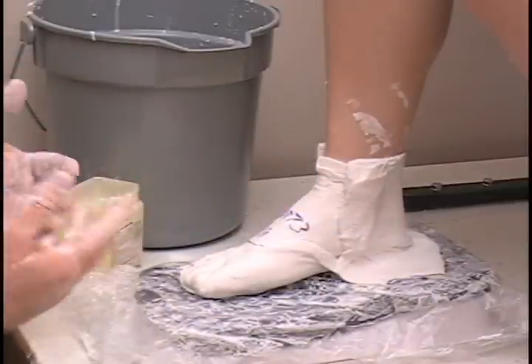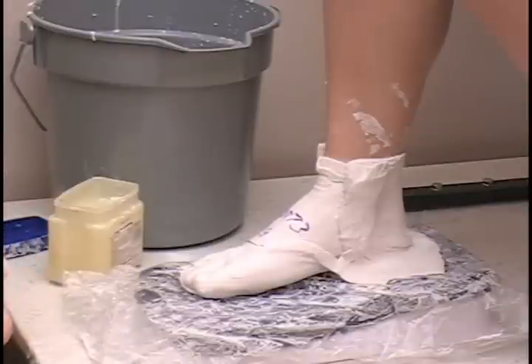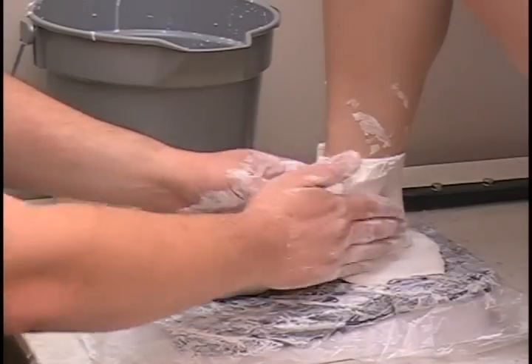At this point, as it is setting up, you may want to fill out your work order form. Important things on the work order include the patient's name, the style of the shoe you have picked, the color of the shoe, and the style of the foot orthotic you have chosen.